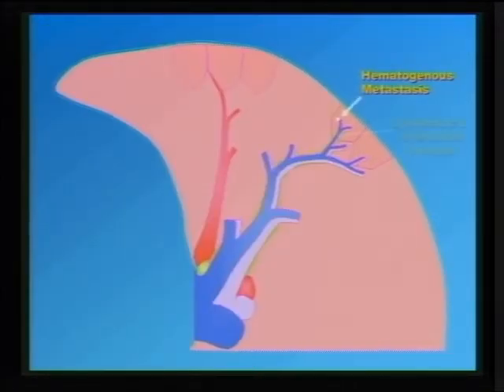But in order to recognize lymphangitic spread of tumor, you have to know the pathophysiology of how you get lymphangitic spread of tumor. So you have to have one of two conditions to be able to make that diagnosis. So you see the thickened interlobular septa, you see it's beaded. Now you may or may not know that the patient has a pre-existing cancer. But then what you need to be looking for is two things. One is to see already the presence of hematogenous spread. Because what happened is that there are already hematogenous metastases, and then the tumor is picked up by the lymphatics, and then it goes in an antegrade fashion. You know, the lymphatics go from the periphery to the center of the lung toward the hilum. So what you have then, if you want, is antegrade engorgement of the lymphatics by tumor deposit.